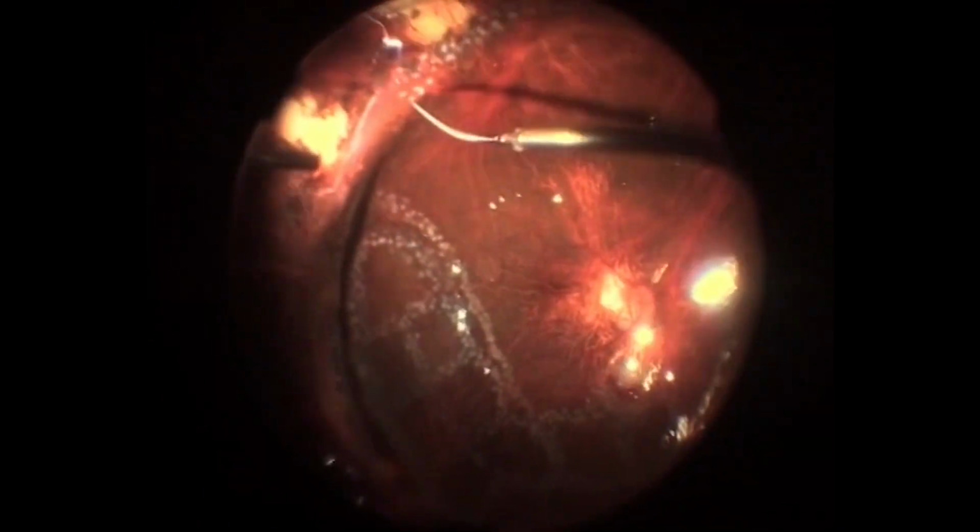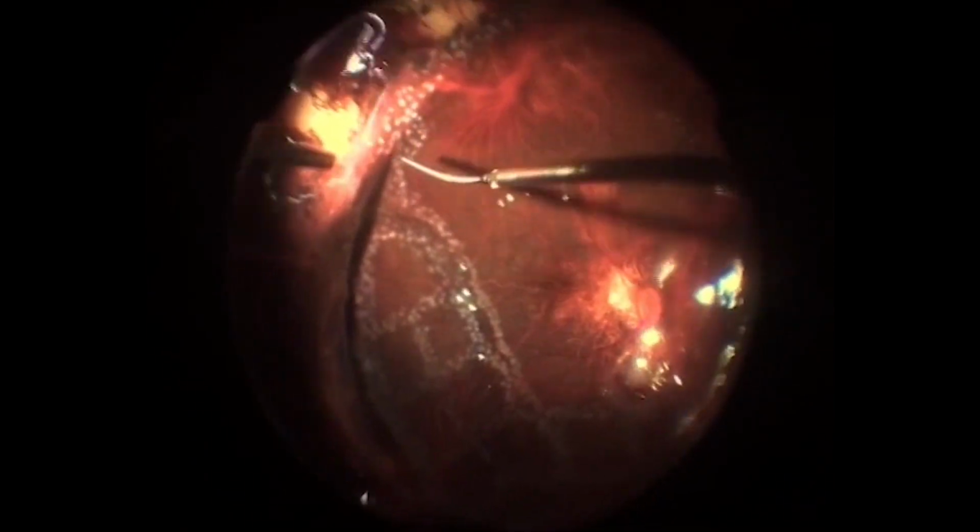It was the only seeing eye, and removal of buckle would cause a large scleral defect and chances of bleeding, hypotony, phthisis. Early post-operative period was uneventful with attached retina under oil. With stable vision and intruded buckle, patient had best corrected visual acuity of 5/60.